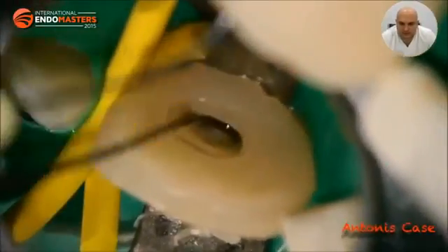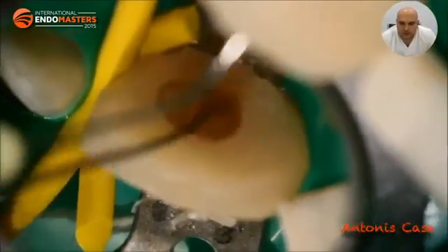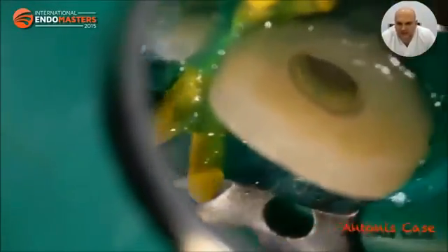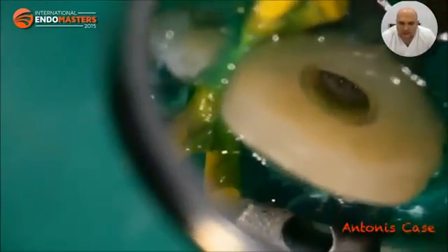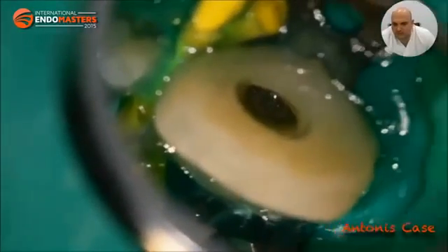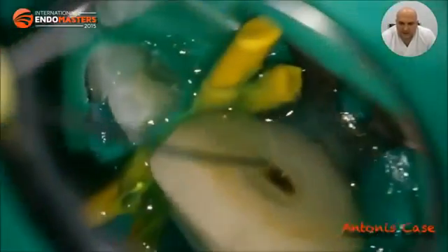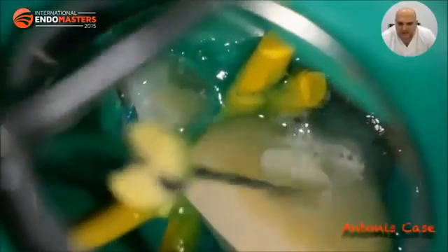and then started irrigating with sodium hypochlorite 6%, then flood the canals with sodium hypochlorite, perform passive ultrasonic activation of the irrigant again, rinse with sterile water and flood the canal with EDTA. This is the passive ultrasonic activation of the irrigant, of the sodium hypochlorite that you can see in the video.